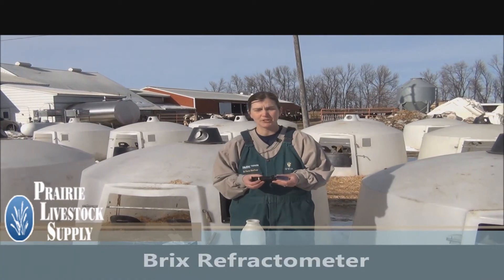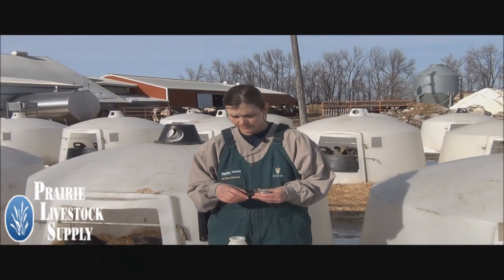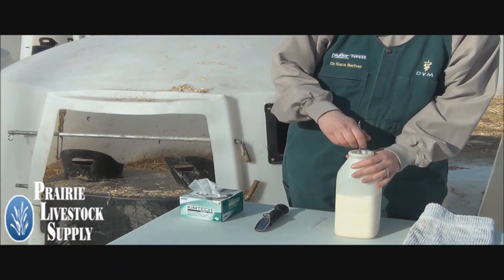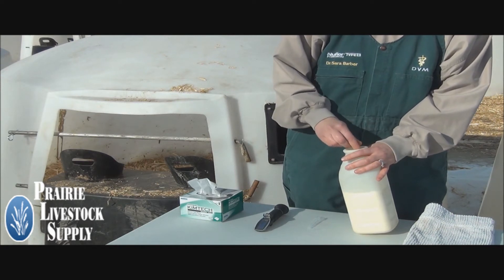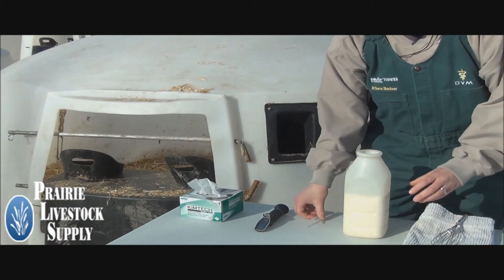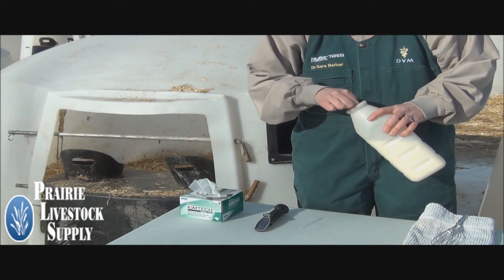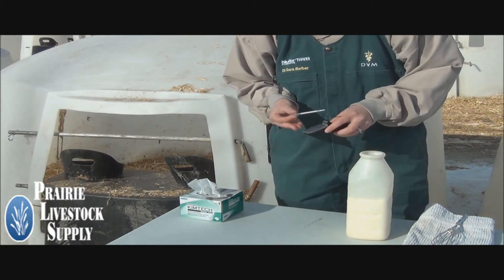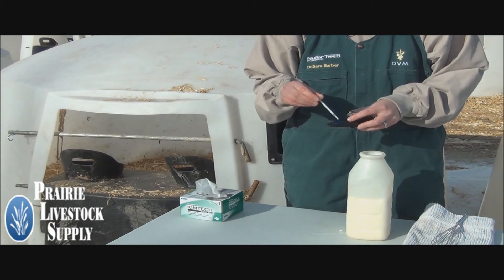The Brix Refractometer is a tool that can be used on farm to determine the quality of colostrum. The first step to use it is to stir your colostrum. The temperature of the colostrum will not affect the accuracy of the test. Then pull up a small amount of colostrum, making sure you get below the level of foam to get an accurate reading.